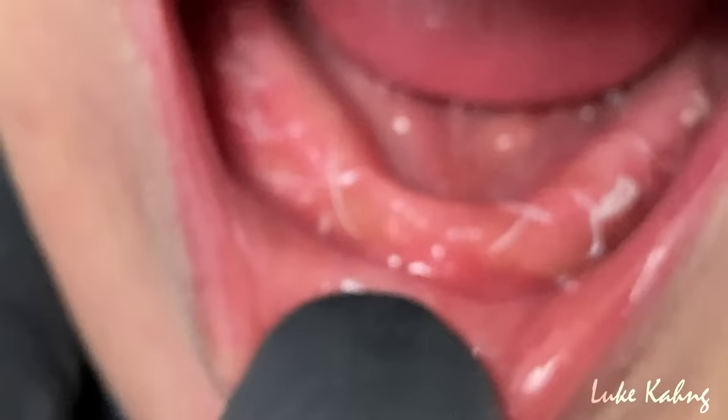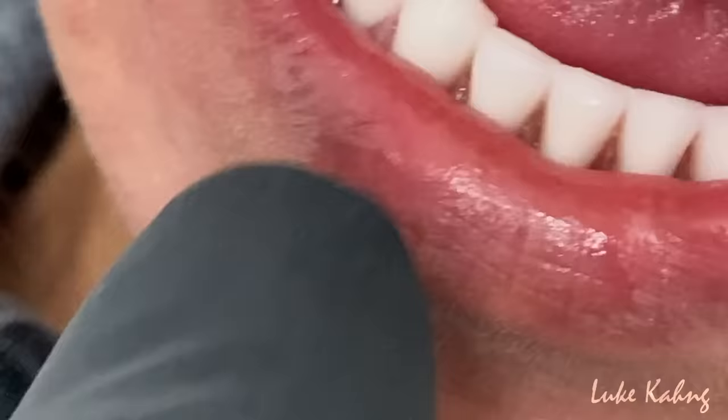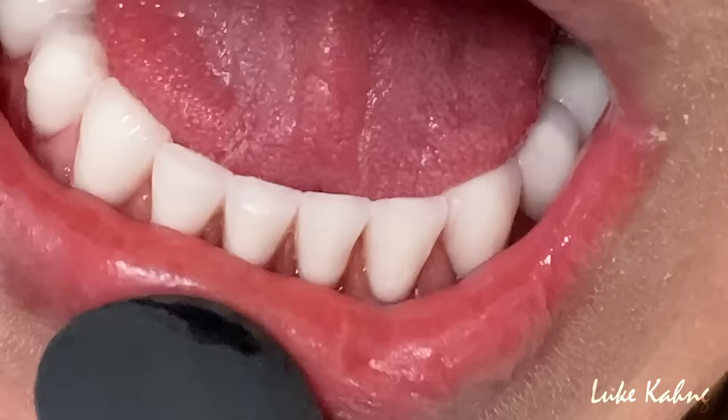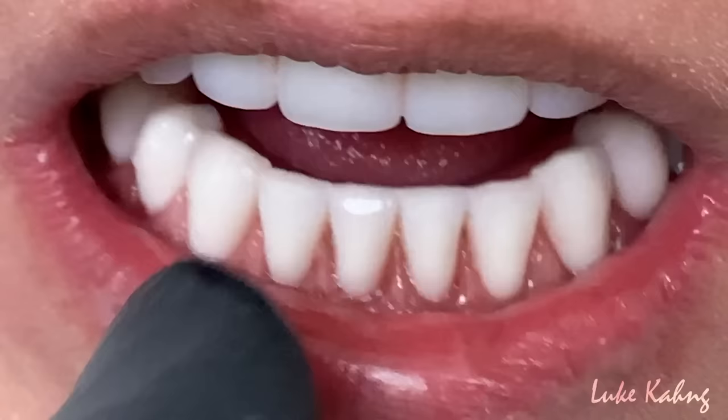We're good. Quiet. She's doing a lot better. It went pretty quick. Nice. So this is wax, like she said. Here is a little bit bad, right? So we're going to decrease the bite a little bit. All right. This looks good.